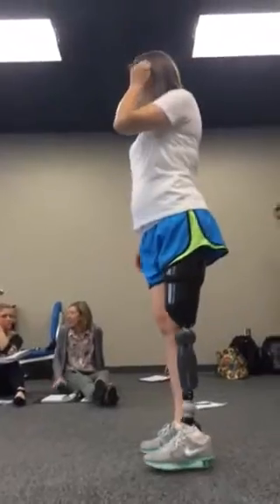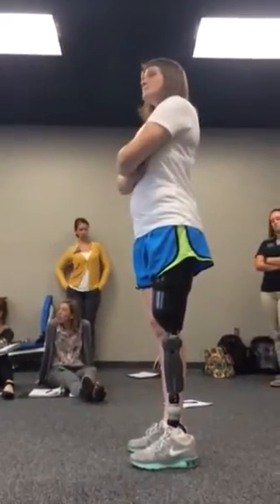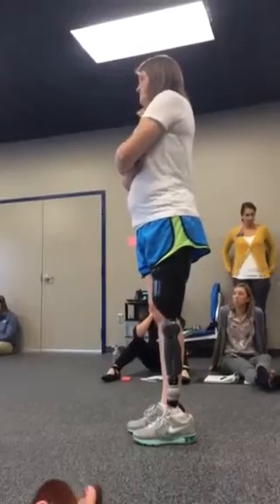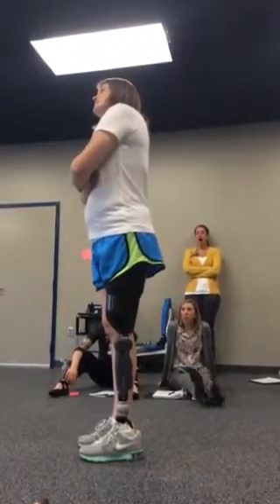All right. So you think the width of walking base is okay? And she's not bringing her sound limb too far underneath to her midline? I don't think she's doing anything that would have her fall or make her not safe. Okay. What about step length? It looked pretty symmetrical.